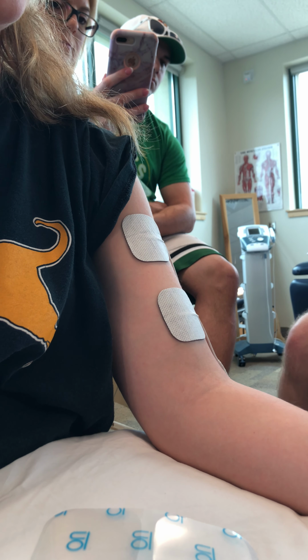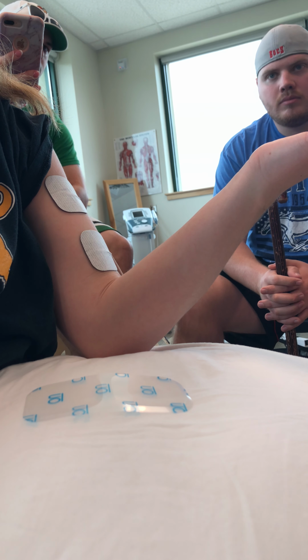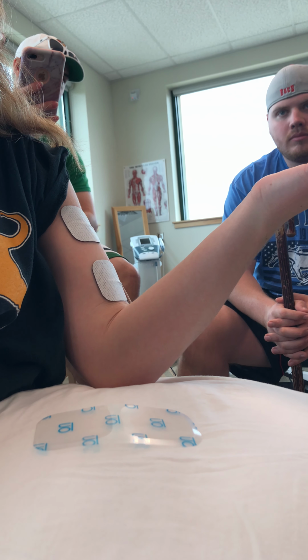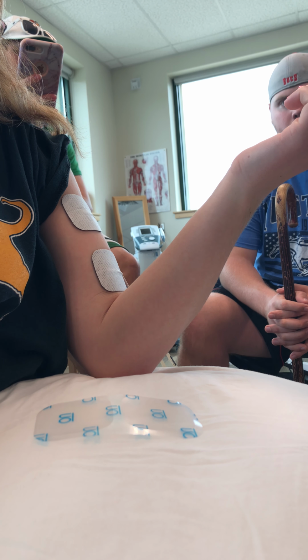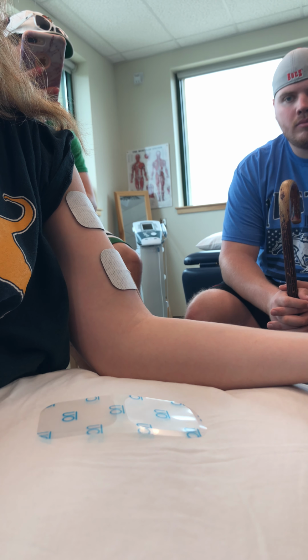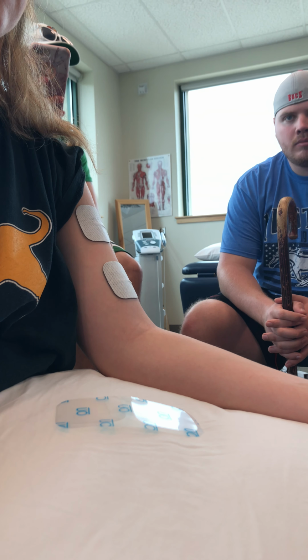Okay, so start. All right, so what it's gonna do is as you feel it, pull it up, pull, pull, pull, hold, hold, hold. It's gonna be on for 10 seconds. Hold, hold, hold. When you feel the machine shut off, you slowly lower to get the eccentric contraction of the biceps. And relax, so it's gonna relax. I have it for 30 seconds, should be 50, but we did 30.